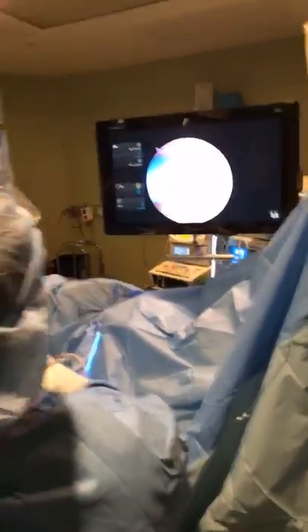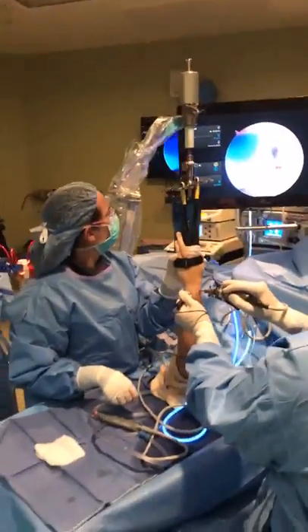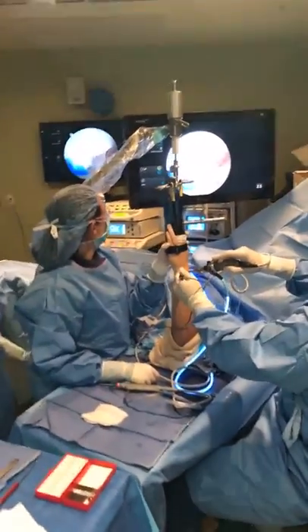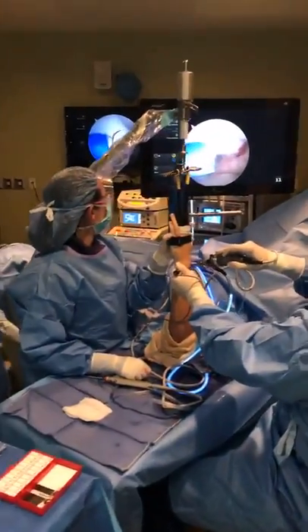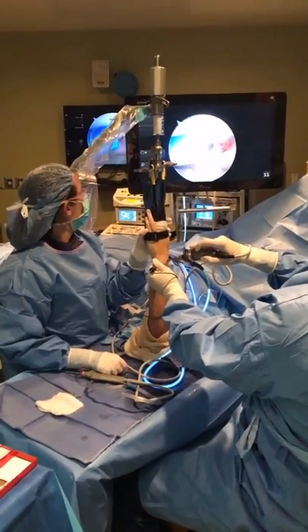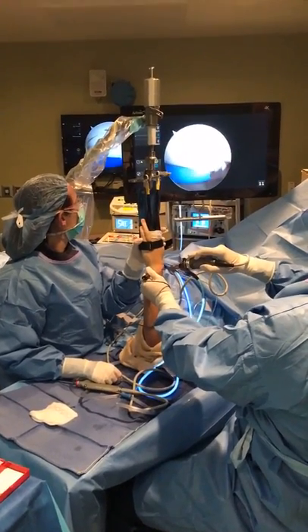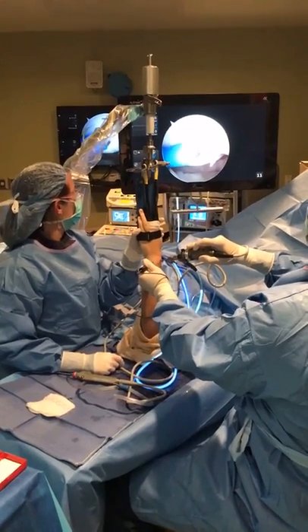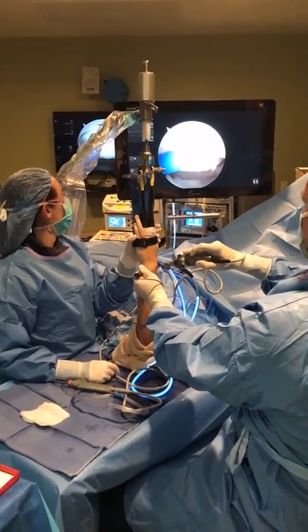Speed up. There we go. Okay, there we go. So that's that. And then here's this part of the ligament. So we would call this a grade one. Here it's a little bit of fraying, but we already determined in the other part of the wrist that this is okay. So we're just going to tighten this up a little bit.